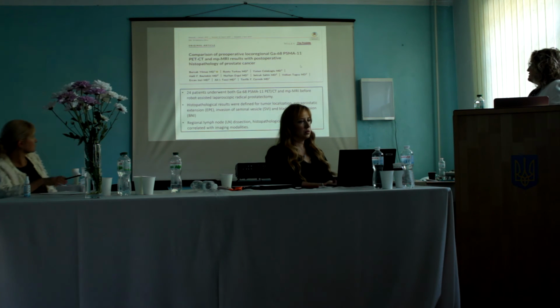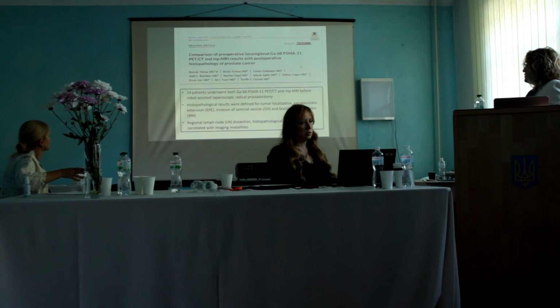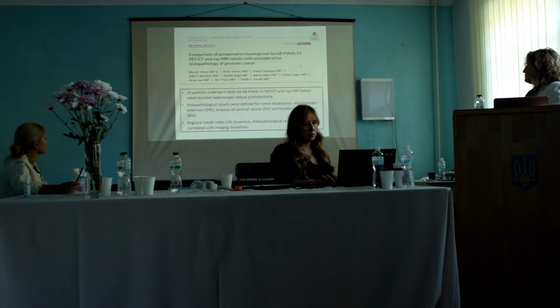In another study from Turkey, 24 patients underwent both gallium-68 PSMA and multiparametric MRI before robotic laparoscopic radical prostatectomy. Histological results were defined for tumor localization, extraprostatic extension, invasion of seminal vesicles and bladder neck invasion, and regional lymph node dissection. Histopathological results were also correlated with imaging modalities.